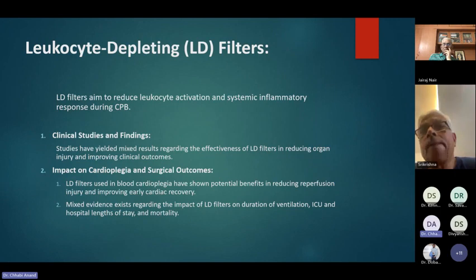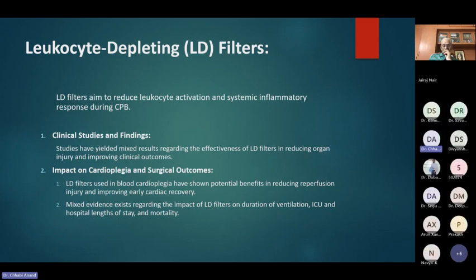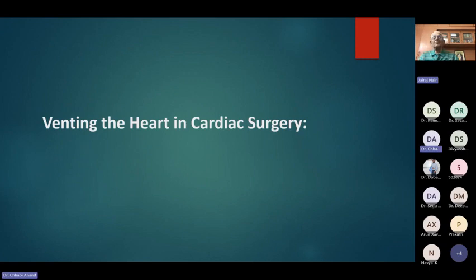LD filters used in blood cardioplegia have shown potential benefits in reducing reperfusion injury and improving early cardiac recovery. Mixed evidence exists regarding the impact of LD filters on duration of ventilation, ICU and hospital length of stay, and mortality. Venting the heart in cardiac surgery.